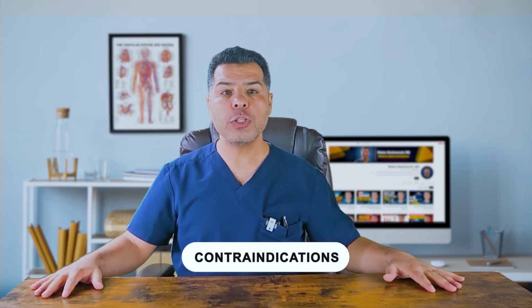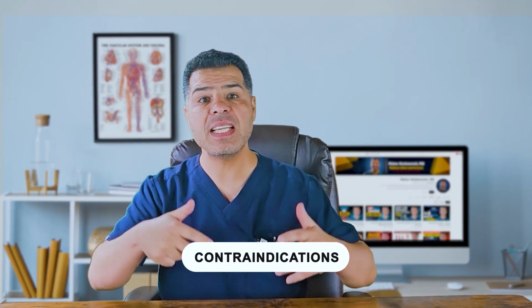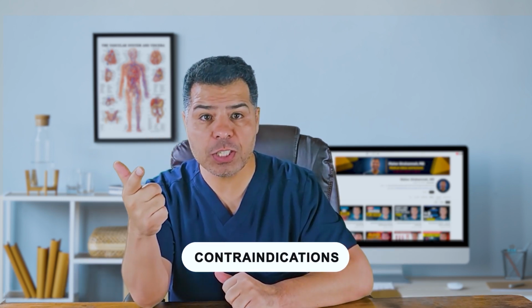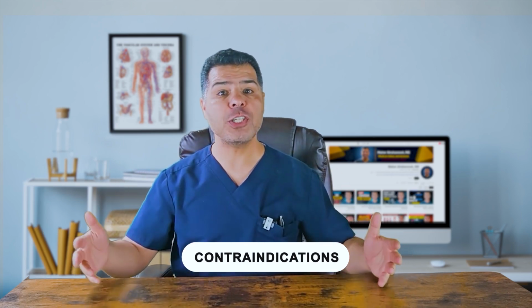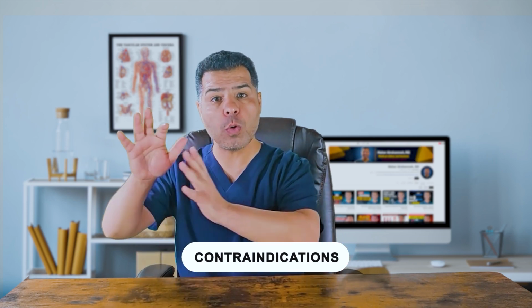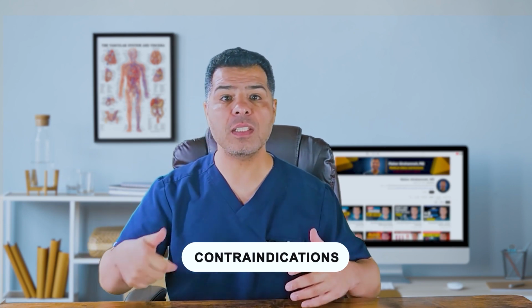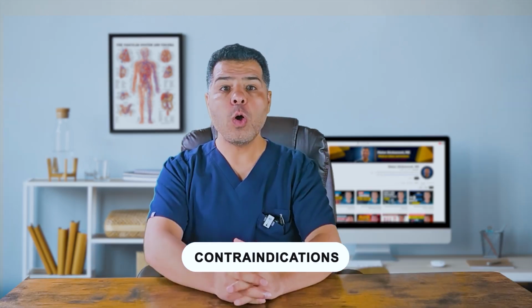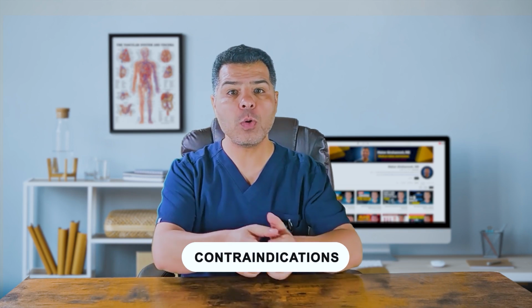Let's talk about contraindications. Avoid placing peripheral IVs, midlines, or PICC lines in a limb that has a prior mastectomy or axillary node dissection, an AV fistula or graft, an active DVT, infection, burns, or open wounds, or a history of radiation or major trauma. Avoid placing a central line through an infected site, distorted anatomy, or if the target vein is thrombosed or occluded. Also, it's recommended to avoid the site with a chest tube, pacemaker, or existing device.